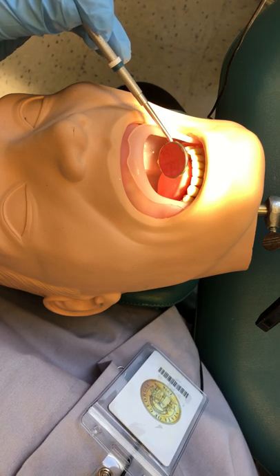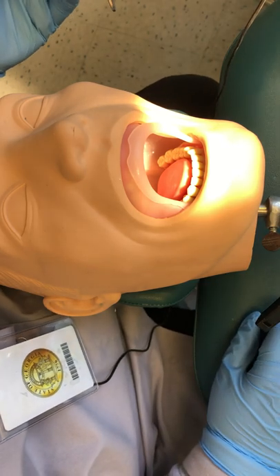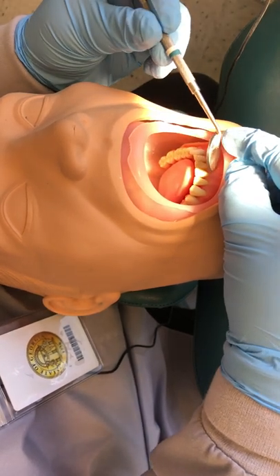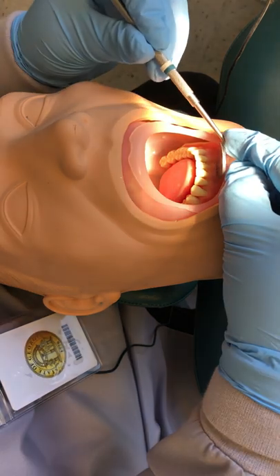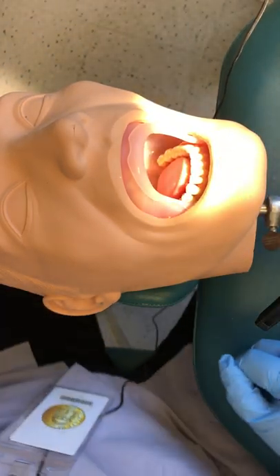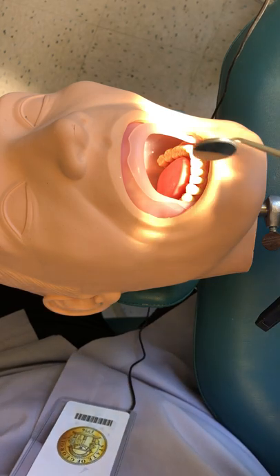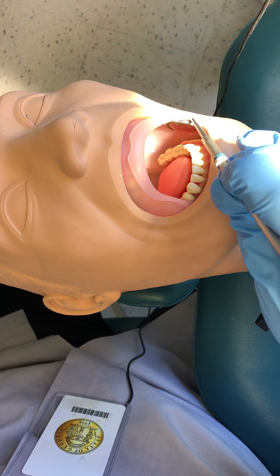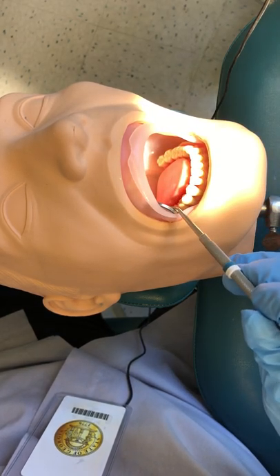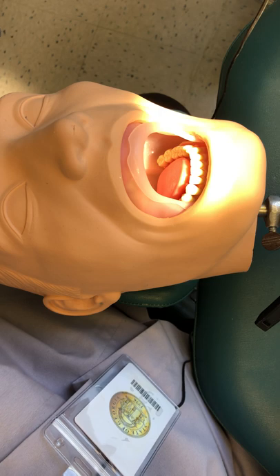If I'm sitting in a 12 o'clock position and I want to look at the facial surfaces of the mandibular teeth, I can use reflection in the mirror to view those teeth. So anytime you cannot see the teeth with a direct line of sight, use your mirror. It will take practice to get used to looking at a mirror image. Everything you do in the mirror is reversed from what you would expect, but with some training you will get used to that. Indirect vision is one of the primary uses of the mouth mirror.